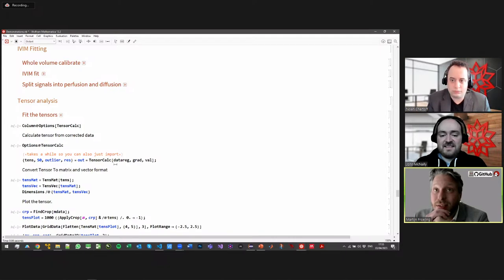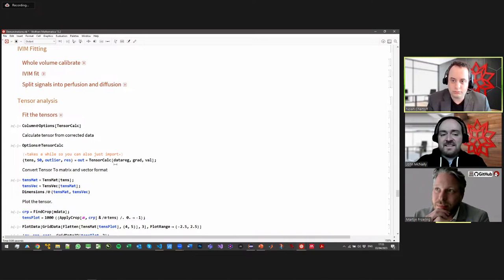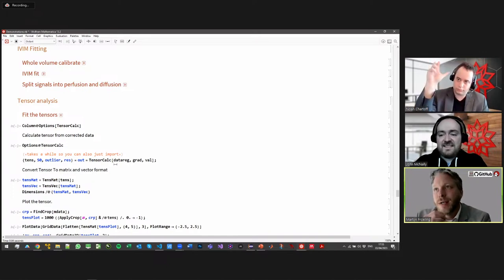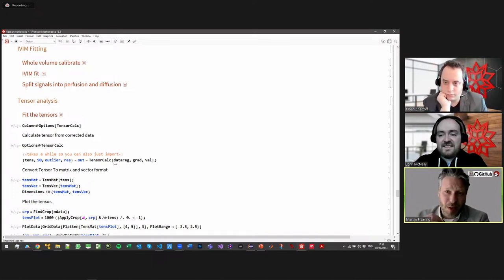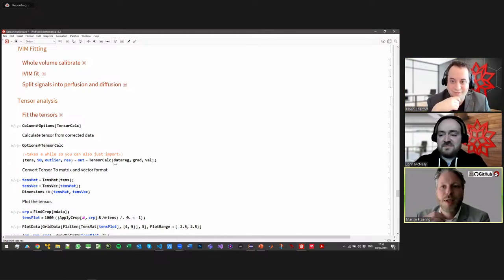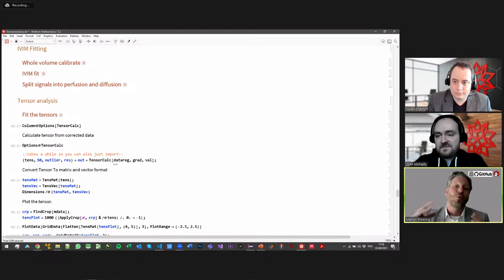Oh, definitely. Science is evolving constantly. I remember when I did my first data set, I was looking at forearm muscles, and the acquisition time of that data set was around 20 minutes. And now I do the same data acquisition in 3 minutes. So the scanner has become better. We have new acceleration techniques on the scanner itself. We don't have to acquire the full data set. We can acquire compressed versions of the data and then uncompress it later on to get the full images again.